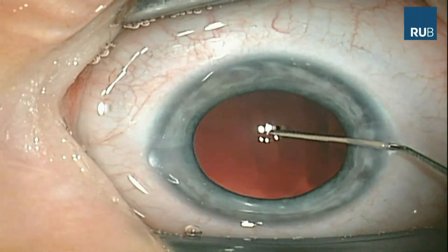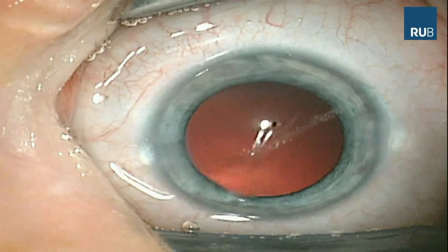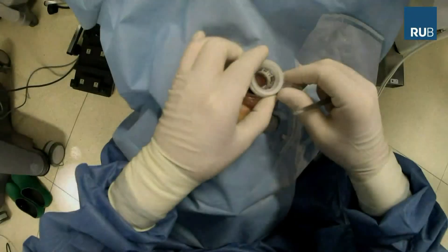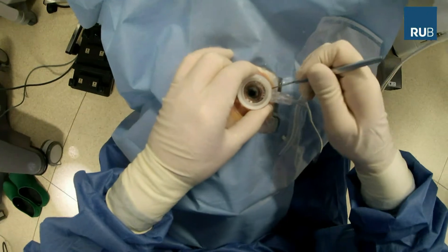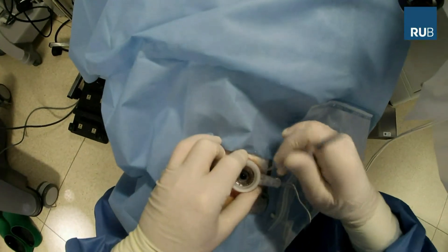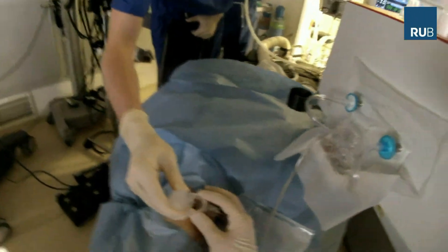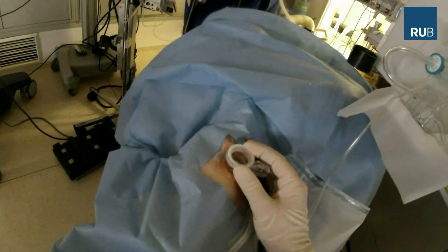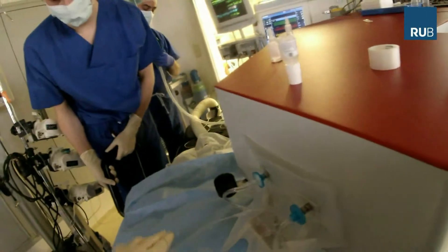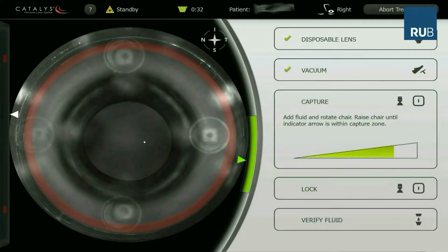The eye is now prepared for the posterior laser capsulotomy by filling the anterior chamber with Healon. Then a redocking is performed using a manipulation device because the general anesthesia slightly lost depth at this point. After the successful redocking, which is usually easy in paediatric eyes, the interface again is filled with BSS. The Catalyst system controls the lateral forces as well as the vertical forces during docking.